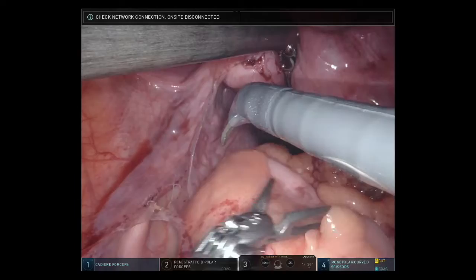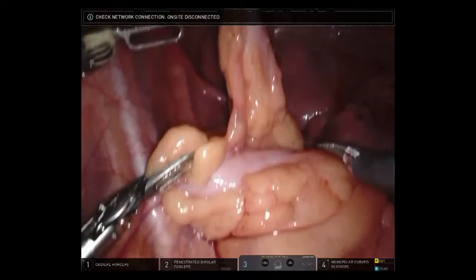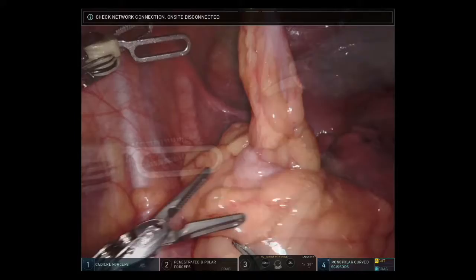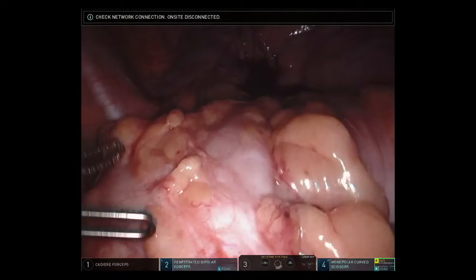Once the pelvis was evacuated, we turned our attention to the long Hartmann's stump that was brought up to the anterior abdominal wall. Further investigation revealed a nest of twisted colon that was tethered together with many inter-loop adhesions. Using electrocautery, we took down the Hartmann's stump from the anterior abdominal wall, which aided in the investigation of the diverted distal bowel.